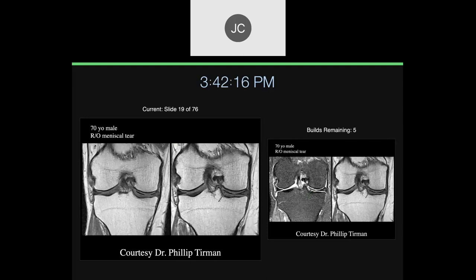This is from Dr. Tirman — a 70-year-old male they were concerned about regarding a meniscal tear, but he was concerned about something else. We see linear low signal in the lateral compartment. This is the lateral compartment, this is the medial compartment, there's a medial collateral ligament, and this is the lateral part. On this PD fat sat image, what could this low signal be? It could be a discoid lateral meniscus.